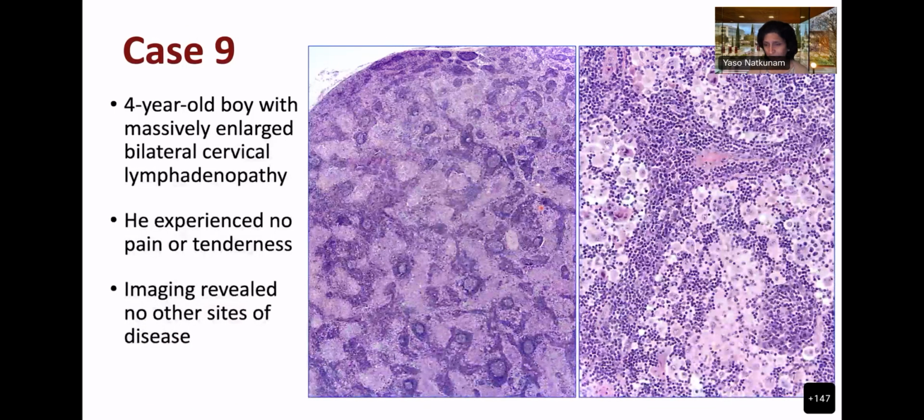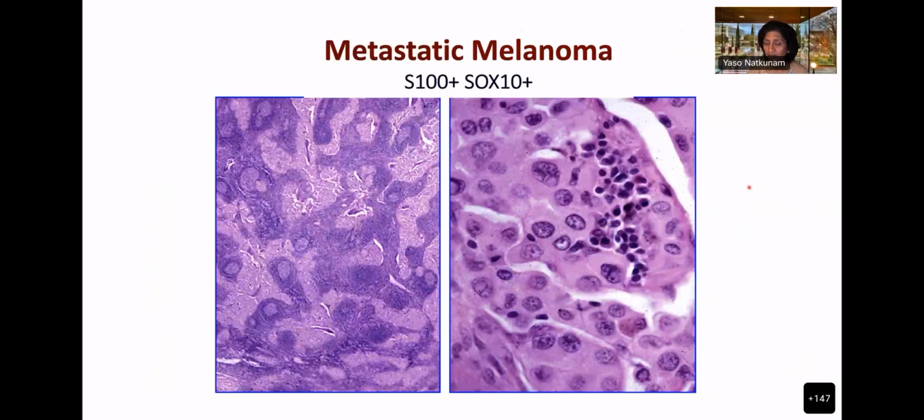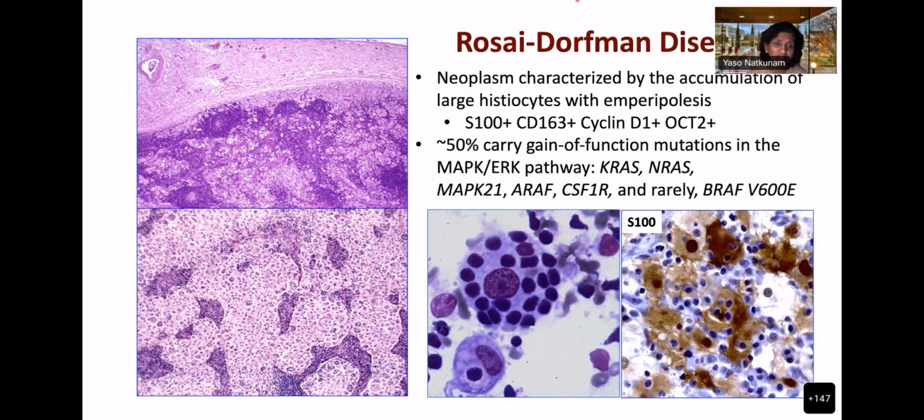Similarly, where's my Rosai-Dorfman case? Several of these markers can overlap. Cyclin D1 can also be seen in reactive histiocytosis, so it doesn't differentiate it. But OCT2, PU1, these transcription factors are actually very good at highlighting these cells, and that is more unique to Rosai-Dorfman disease. So some of these newer markers have helped, and we don't typically do molecular for this. It's distinctive enough that you can do without. So definitely the answer is dermatopathic lymphadenopathy. And sometimes dermatopathic lymphadenopathy can be pretty overwhelming, and it can efface the node. It starts in the sinus, but it can be very extensive and definitely can overlap.